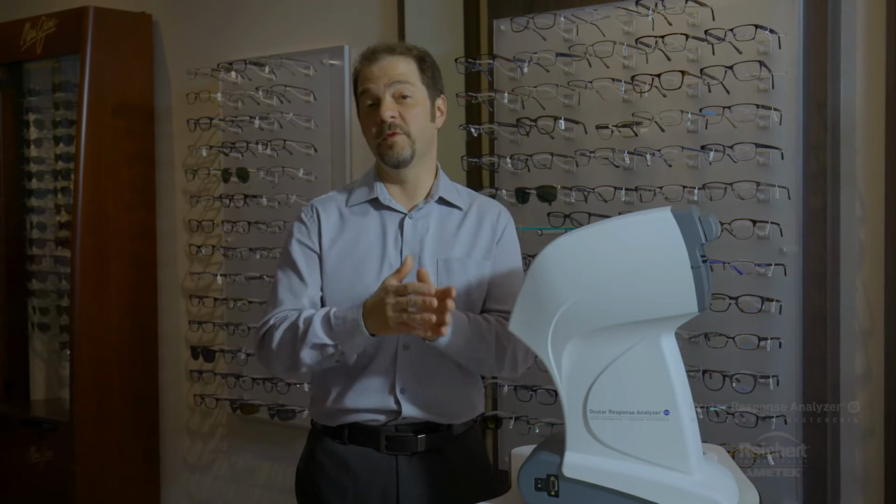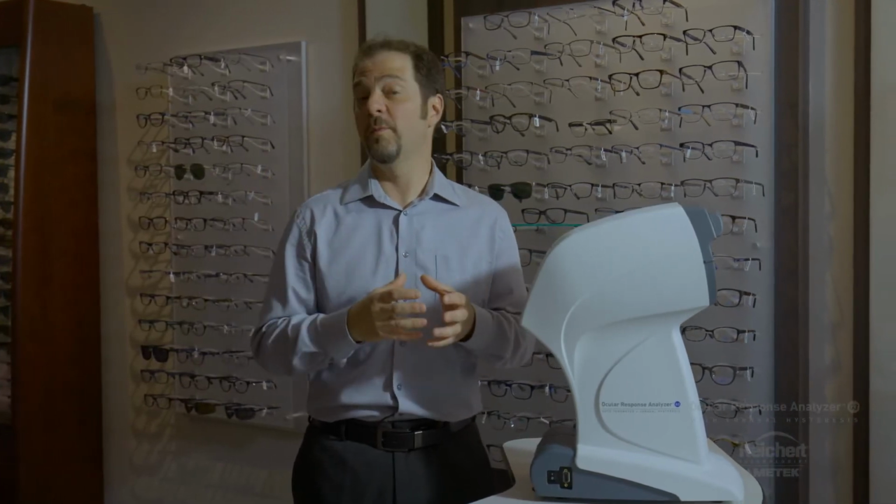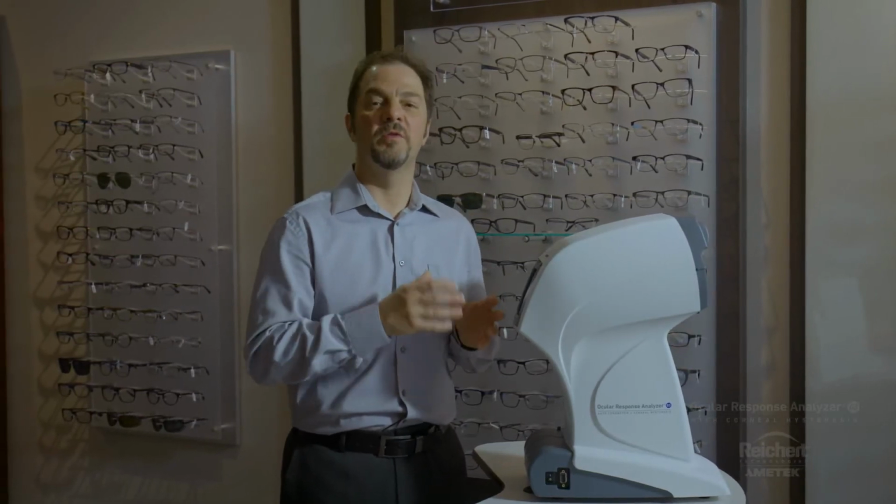So it's possible if you measure one eye and then measure the other eye, that you catch one eye at the peak and one eye at the trough of the cardiac cycle, and this can cause an actual pressure change. And because this measurement is so rapid, it captures that actual pressure change. So you're looking at a difference that really occurred due to the ocular pulse. If you think this might be the case, go ahead and make multiple measurements, and the intelligent averaging system should average out those ocular pulse-related pressure changes.